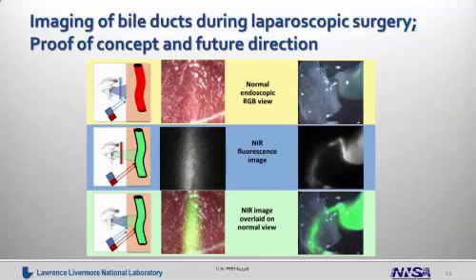In this case, the top images show what is visible in the example shown in the presentation, the muscle tissue and the intestinal connective tissue walls, and we can see well behind those and detect the feature of interest that we need to preserve. And we can create composite images that can be presented in real time.